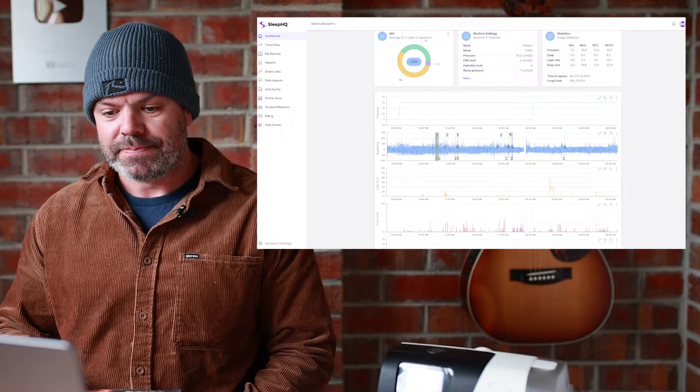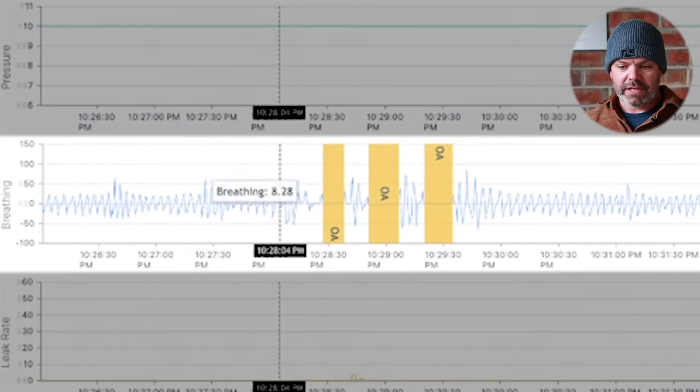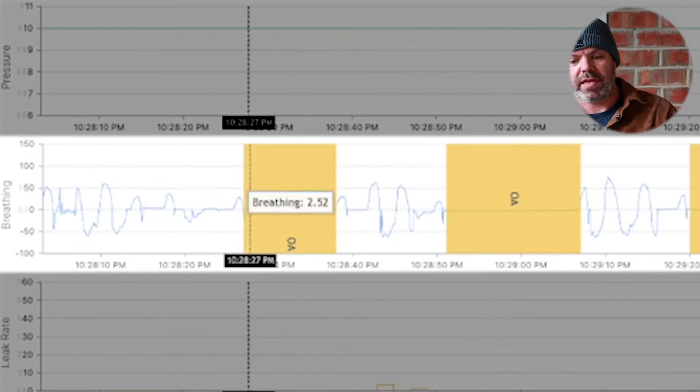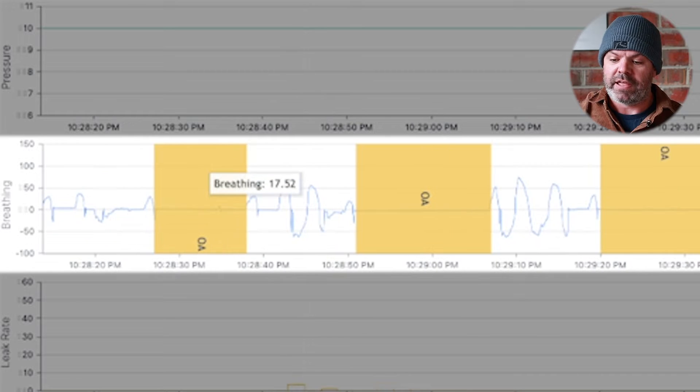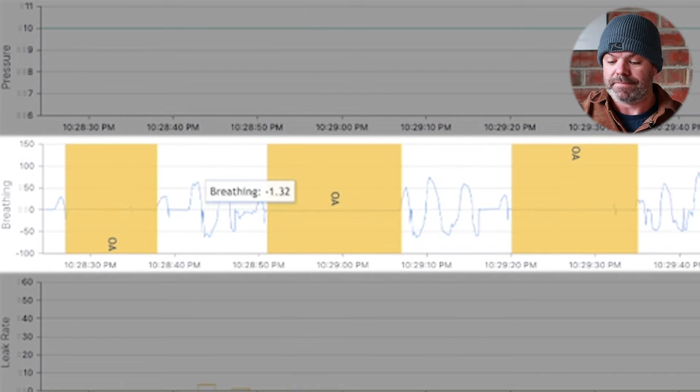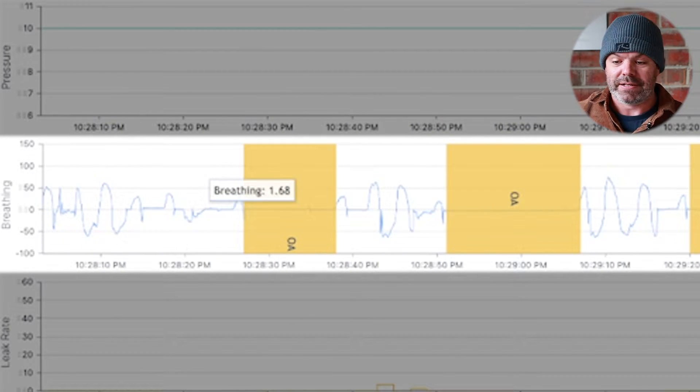Here we are and we're done. We can zoom in right here — there it is! Every breath, every apnea, right there in high definition, in under one minute.